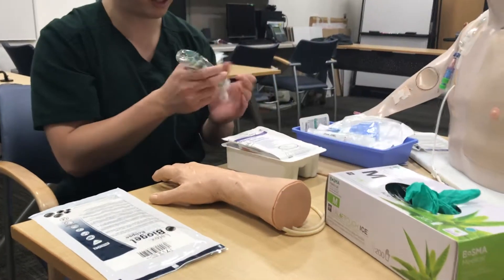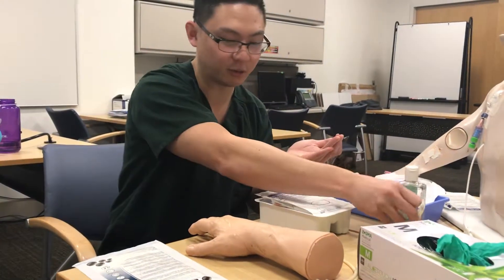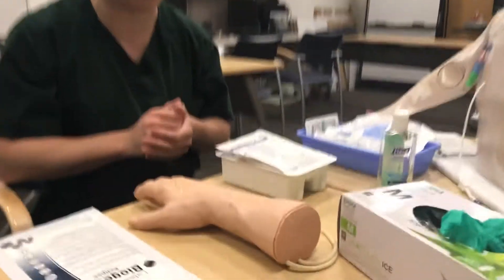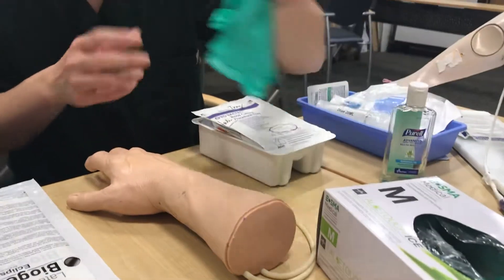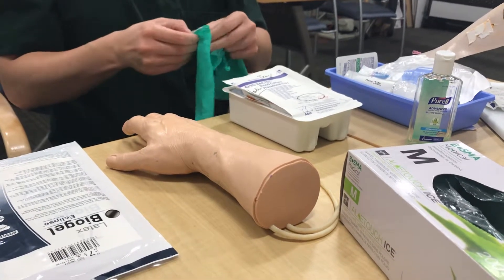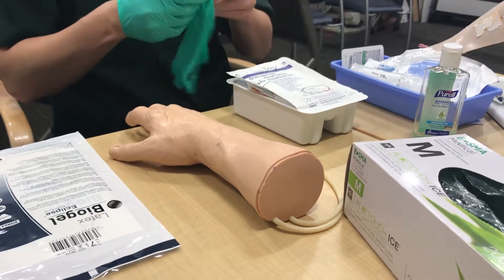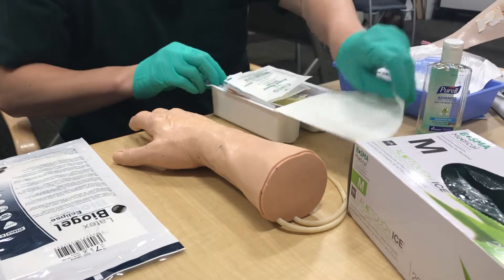First things first, you're always going to wash your hands first. Evaluate the areas where you might potentially get a blood culture. You can look at the hand — this particular hand has a lot of veins that are easily visible. Take your first set of non-sterile gloves and, after you've evaluated your site, open your kit and see what's inside.